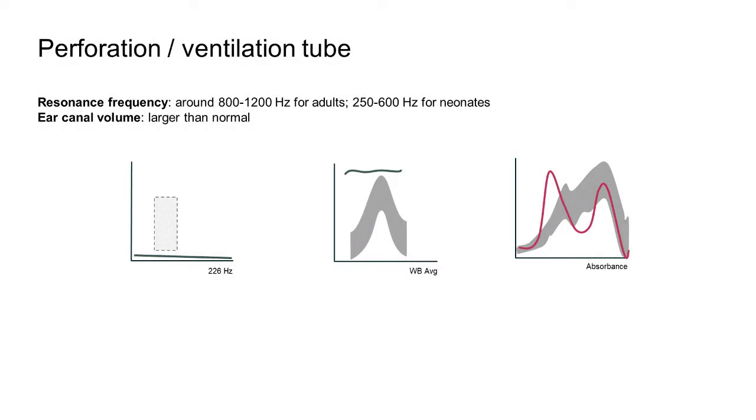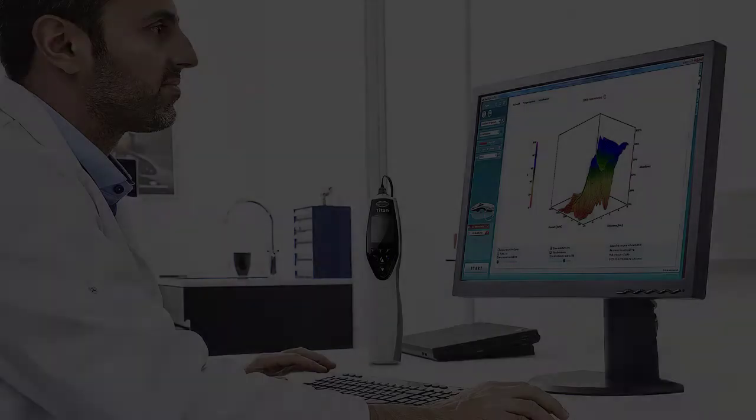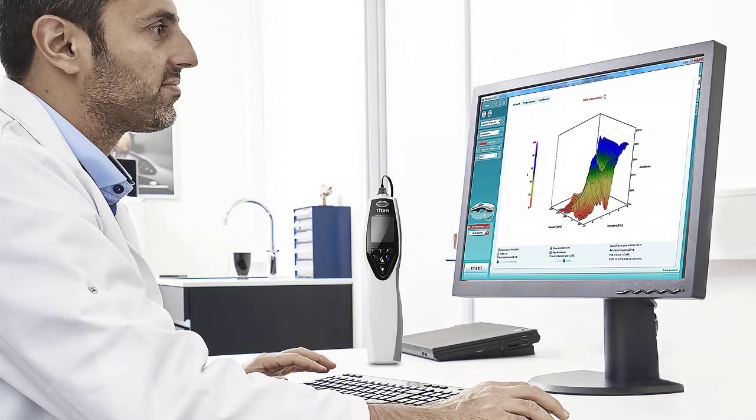It is important to note that multiple pathologies can be present alongside each other, which can alter the presentation of the absorbance graph. Analysis of the average tympanogram, frequency selection and absorbance graphs are the foundations for the assessment of different pathologies.